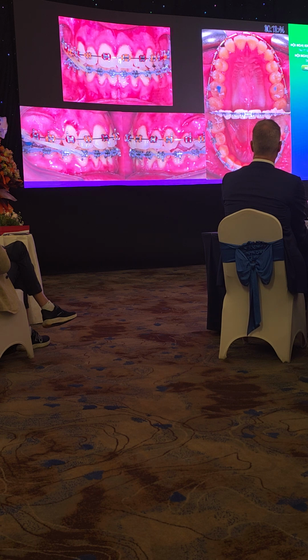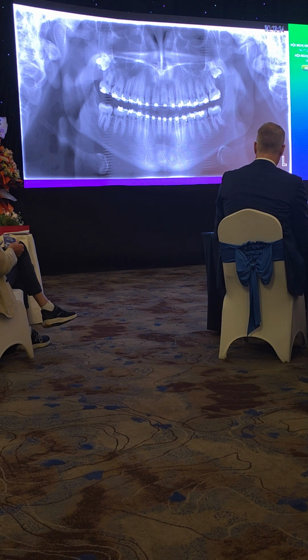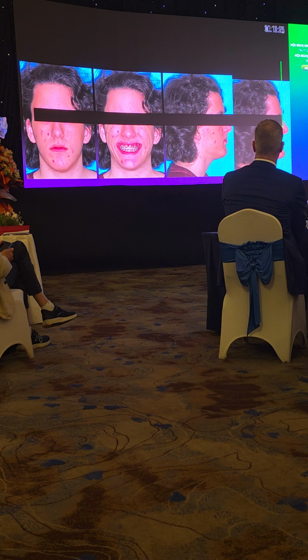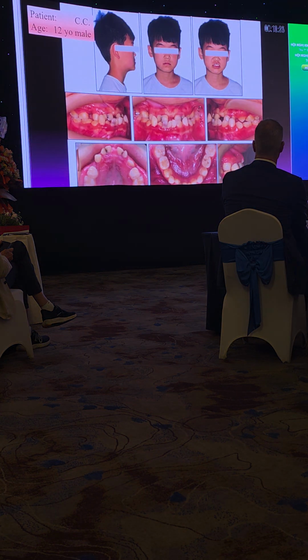But you can see the difference in the arch form, the upper arch and the lower arch, all right? So in this case, we are lucky that we don't need to take out any teeth, okay, and the teeth basically look parallel, and also his upper incisors right now are closer to the green line, so it actually looks better for that reason, all right?